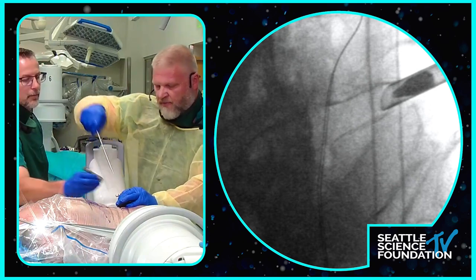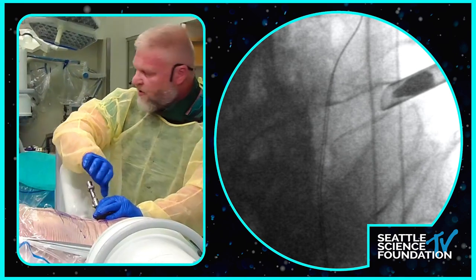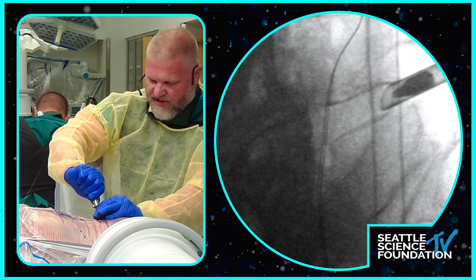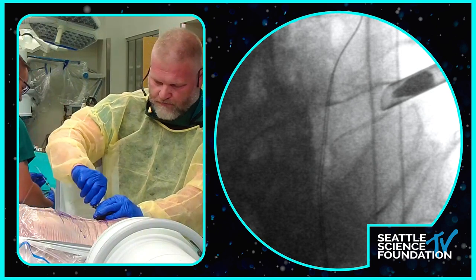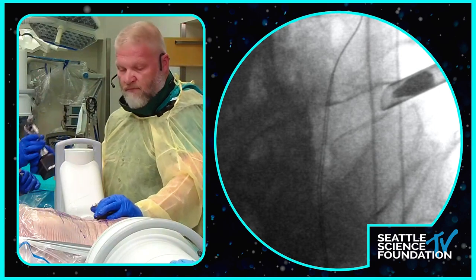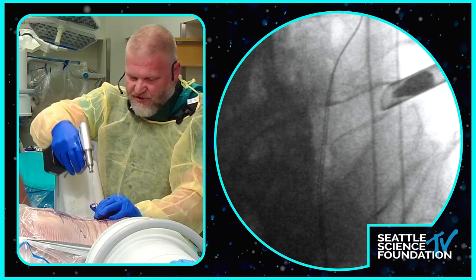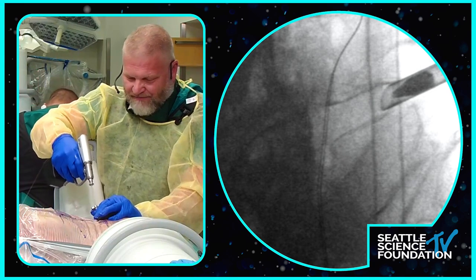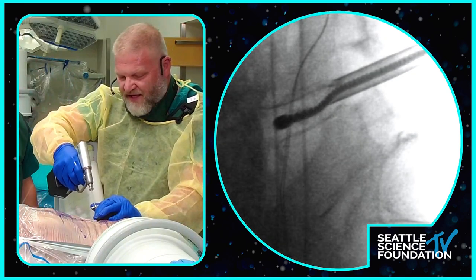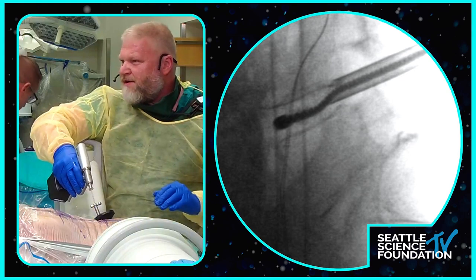Thank you. Pull that out. And you have just a brush. Give me just a brush. I'm going to just hit this with a wire brush real quick. So you can adjust the depth of these things, but these brushes are nice because they debulk a lot of the disc. Shot there.